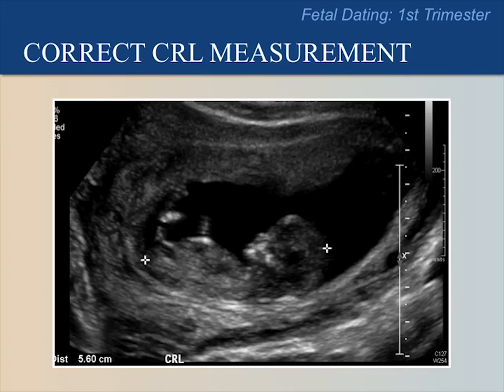In this view, notice that the fetus is in a neutral position, not flexed or extended, and in profile, meaning that you can see the face. Notice that the calipers are properly positioned on the top of the head and bottom of the rump.